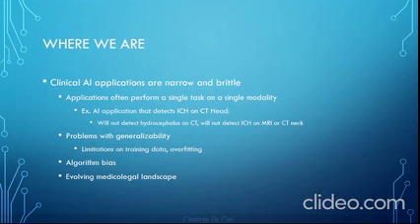The development and deployment of more comprehensive and more advanced applications has faced a number of technical stumbling blocks, one of the most significant being problems with generalizability. Generalizability is the ability of an AI application that has been developed and trained on a specific set of data to be able to perform as well on data from the general population.